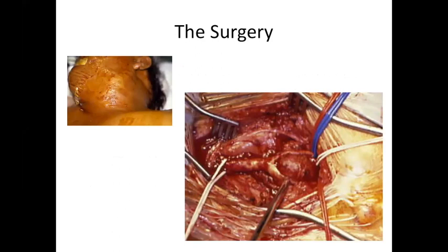Well, the surgery, probably many of you are familiar with this, includes the usual positioning and exposure. We are very careful to dissect everything, especially the distal controls of the ICA, before we start removing the tumor. With the advent of bipolar and ligatures, the dissection is slightly easier. I myself like using unipolar, to be honest. You get to a degree where you're doing this pretty fast, with very limited blood loss, so it's not that risky of a procedure.